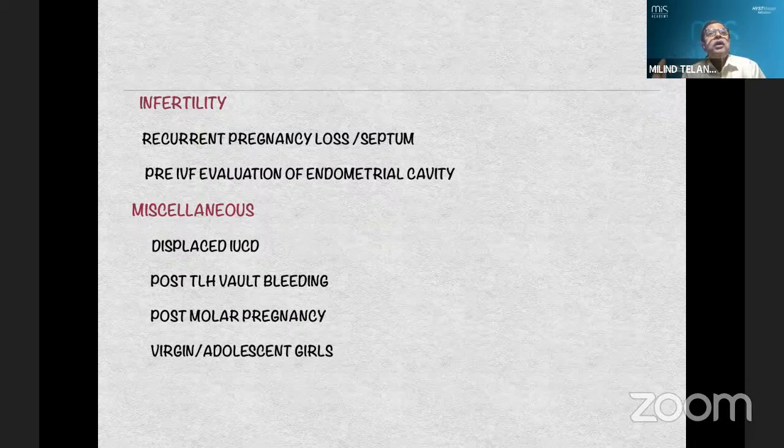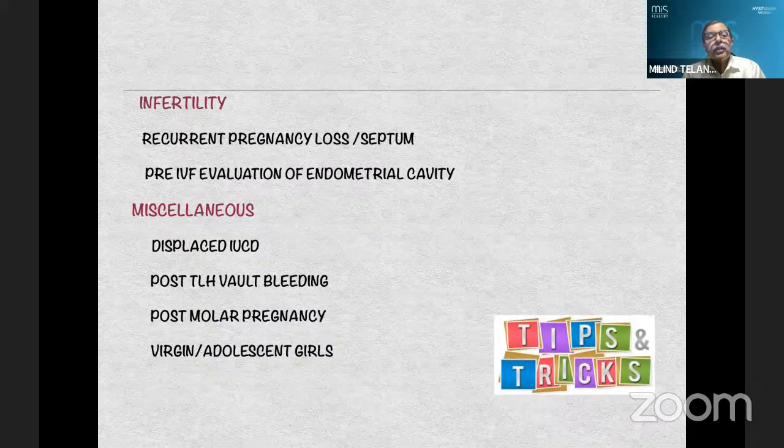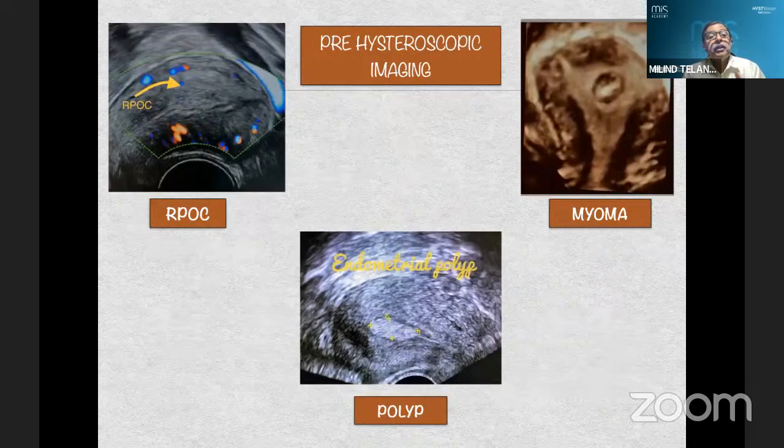Vaginoscopy was discovered in virgin patients only by Bettocchi. He had a problem and how to negotiate, and it conforms to the anatomy of the hymen. The hymen is around 5 to 7 mm in its opening, and therefore a 5 mm scope easily goes without traumatizing the hymen. So this is an important thing, knowing the right diagnosis.